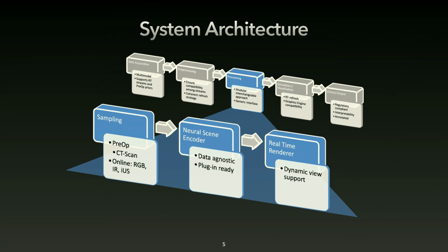So what I'm proposing here is a system architecture, and this is what we're going to be speaking about today. On the back, you can see how the system architecture looks. In blue is what we're going to be speaking about today. Like in every system, you have a data acquisition module, which is taking several pre-op data, for example CT scans, and some real-time streams, for example ultrasound, which is streamable in real time, and you can have several other modalities, right?